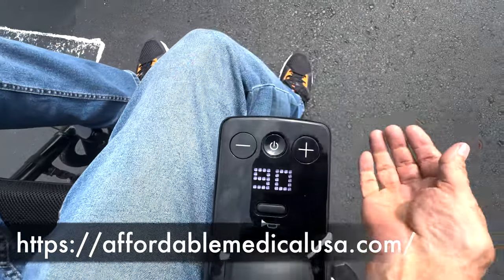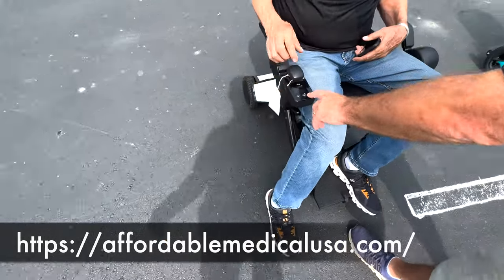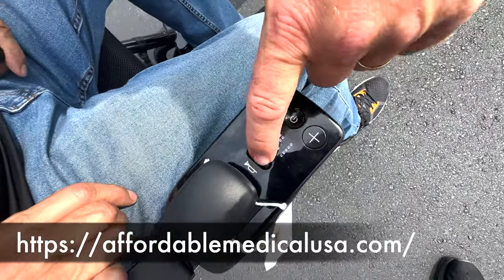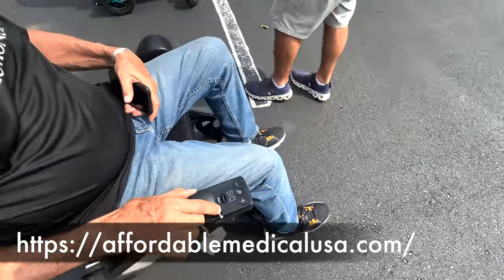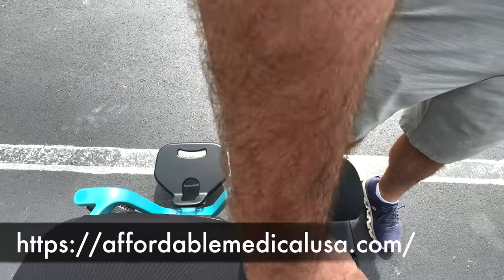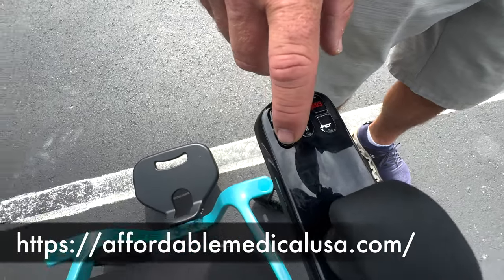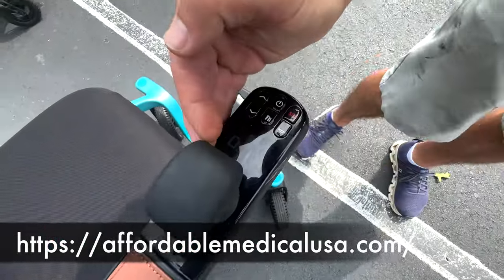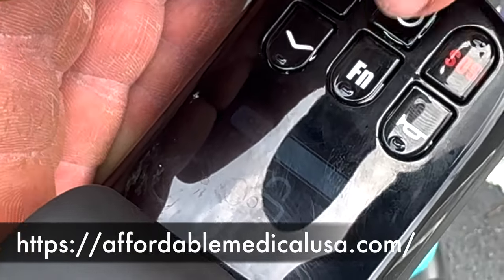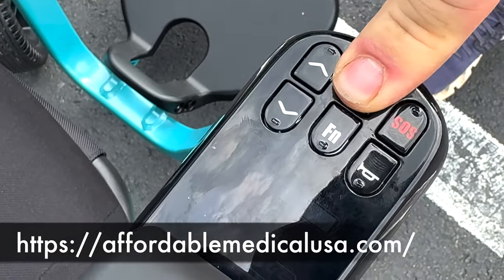Move your hand, Eddie. No, he's moving. Horn. Oh, button, speed control. Slower, faster, power buttons here, horns right here. Over here, they say don't put your hand on this to get up. So put your hands back here to get up where you can be out there. This one makes noise, but you can turn it down. That's your speed. This is your horn. That's just an SOS button. That's your power on, power off, but you gotta unlock it to turn it off. So you gotta hold this, turn it on and off, which you might like, you might not like.